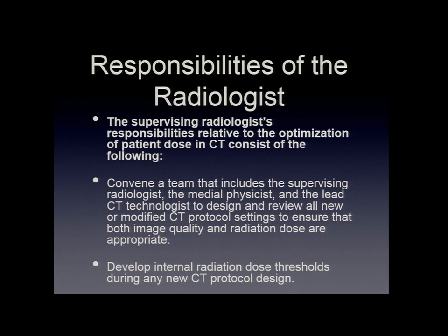And they do that by putting together a team, because they're really quite busy interpreting the images. There's quite a lot of information coming their way, and so they really need the other team members to contribute to this. So they bring the technologists and the qualified medical physicists together and make sure that the protocol settings are valid. They need to validate that the doses are within the established reference levels that we have for the facility, and that the image quality is acceptable.